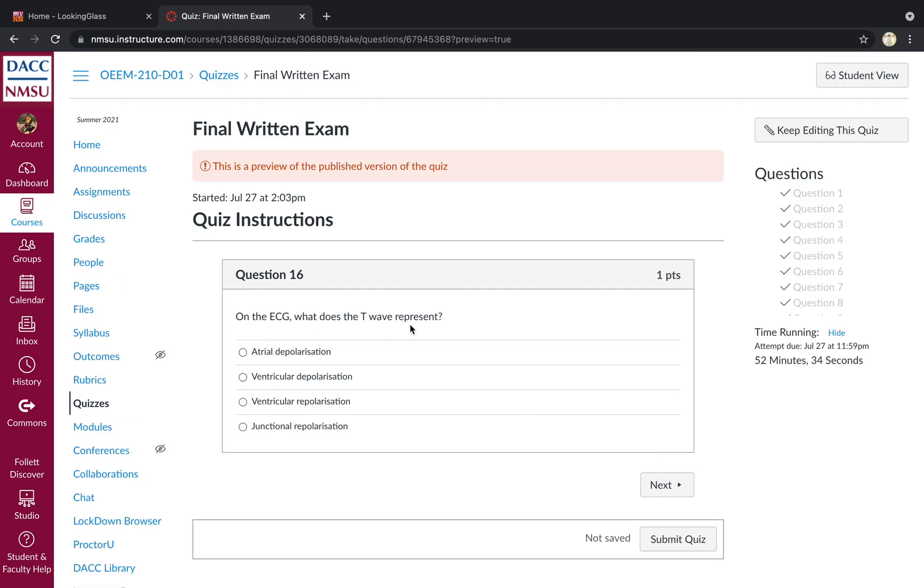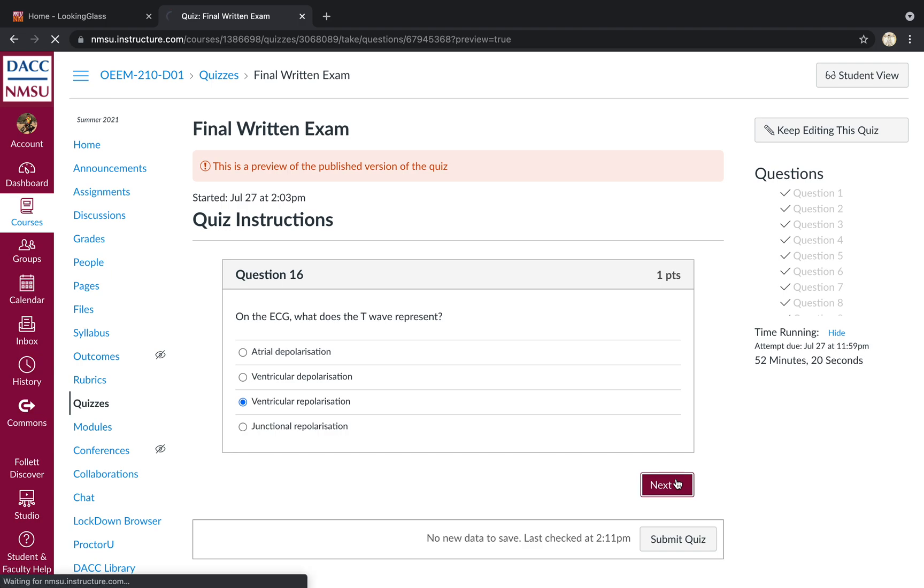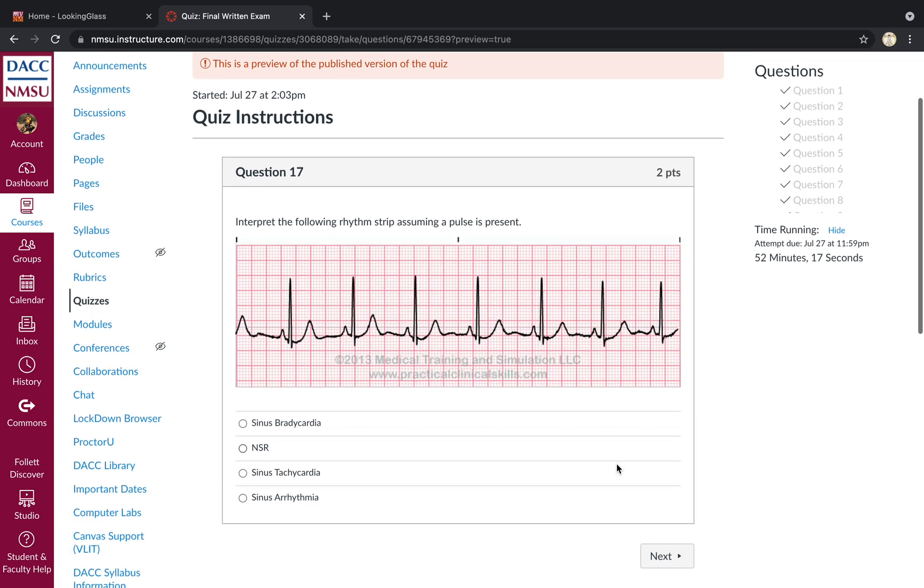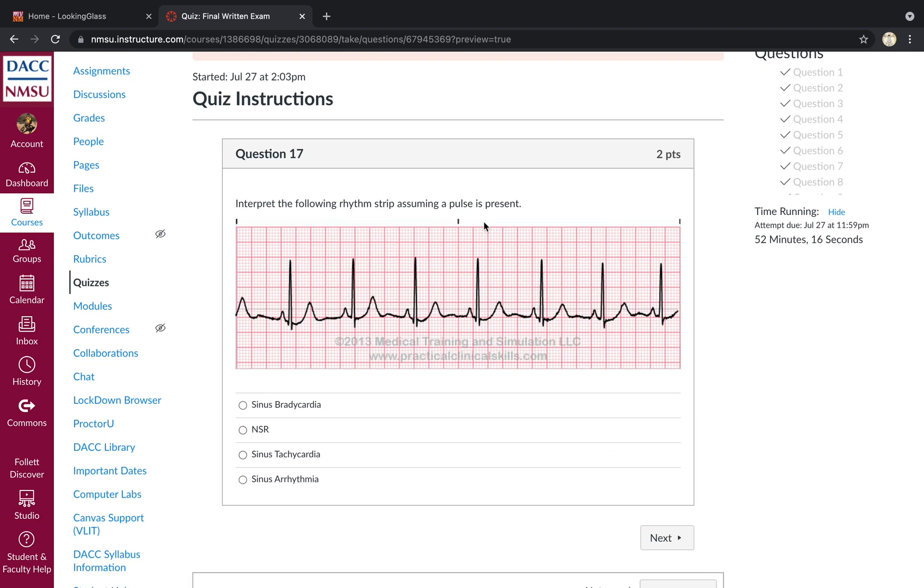On the ECG, what does a T wave represent? That represents ventricular repolarization. Remember atrial repolarization occurs during the QRS complex, and so it is masked. We're not actually able to appreciate that electrocardiographically. Interpret the following rhythm strip assuming a pulse is present. Just normal sinus rhythm. Rate of 80. P for every QRS. QRS for every P. PR is good. QRSs are narrow. And the rhythm is regular.